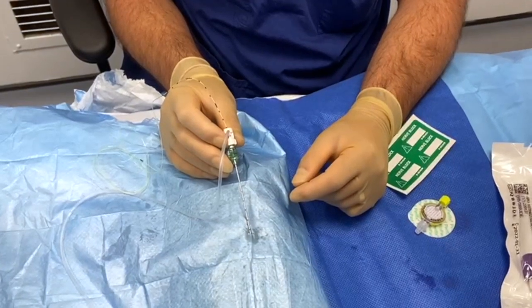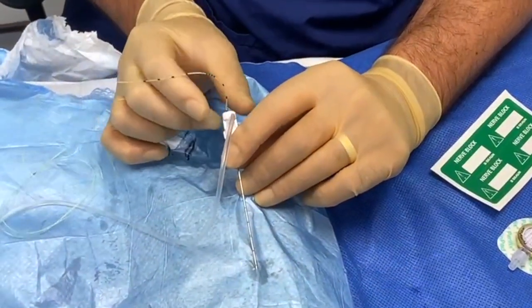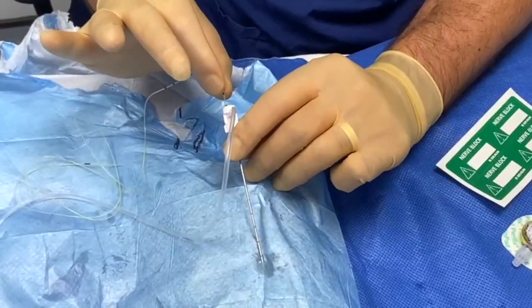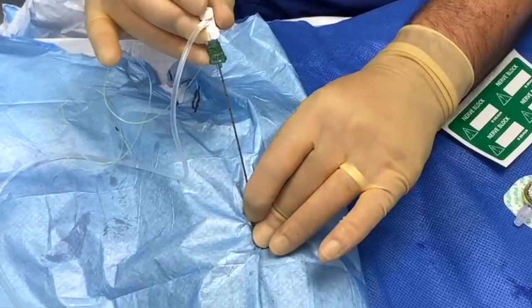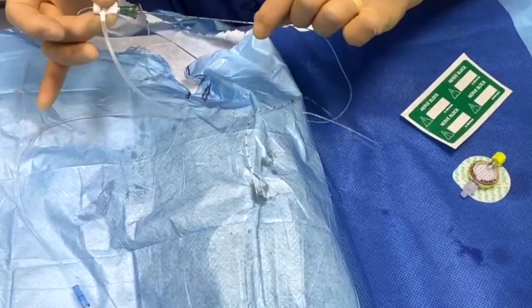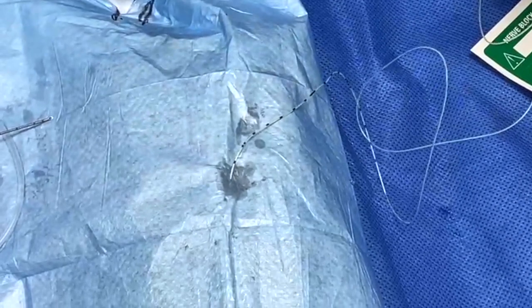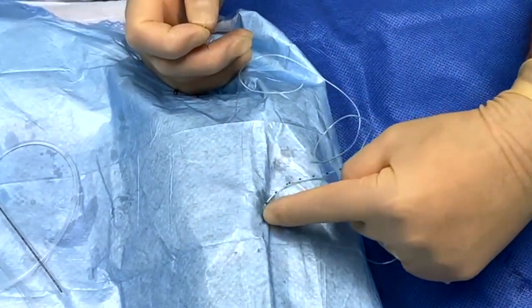Once your needle is in the correct position and you've threaded the catheter — a predetermined amount of between three to five centimetres maximum within the space, whether in-plane or out-of-plane — it's time to remove the needle whilst leaving the catheter in place. You shouldn't need to advance the catheter much because you've threaded sufficient amounts. As soon as the needle comes out, grab the catheter by the skin and remove the needle entirely. Make a record of where the catheter is at the skin — in this example we'll say eight centimetres at the skin.